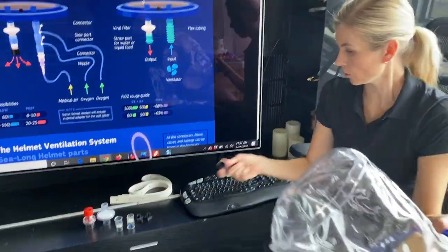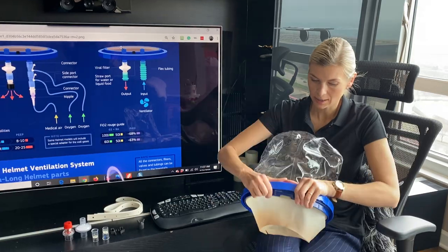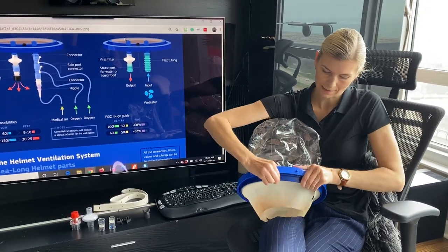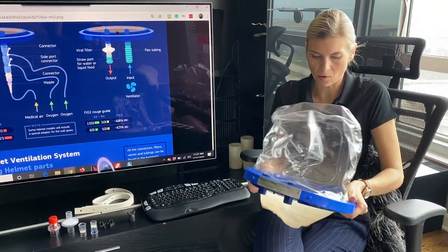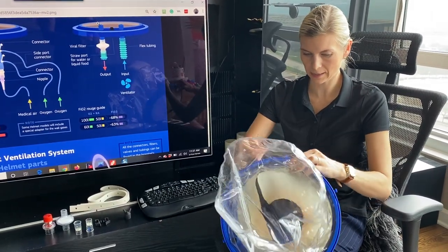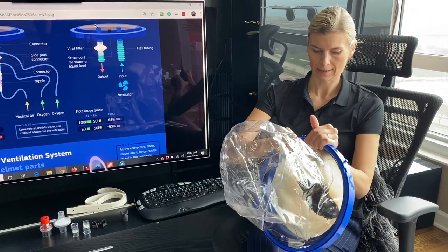I'm going to use this other helmet now because it was used on a patient, so it already has a hole. This is the older version of the helmet.